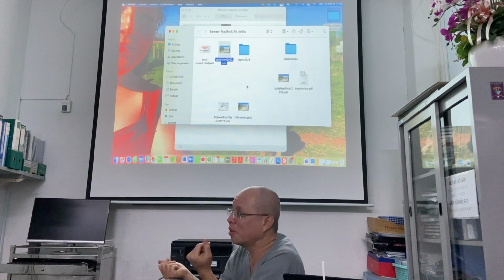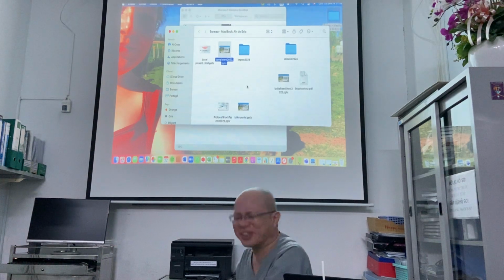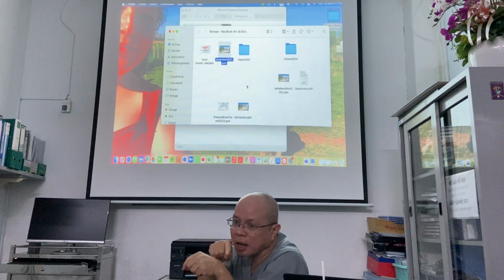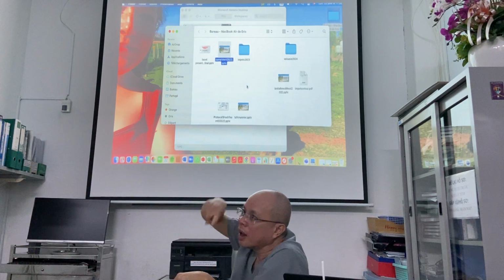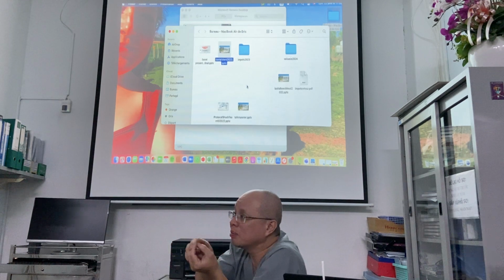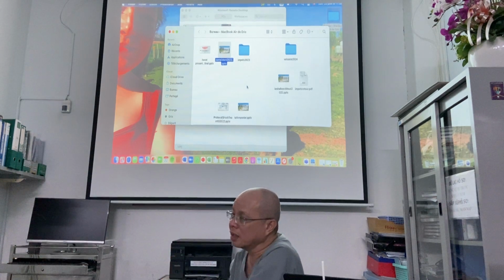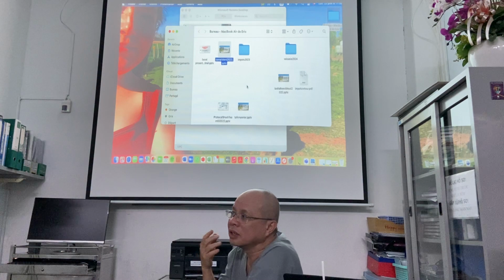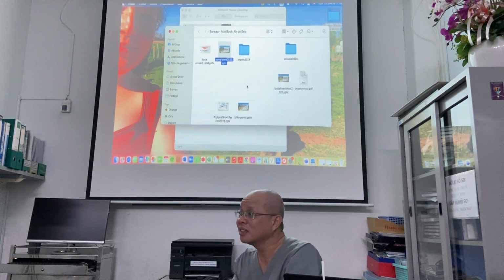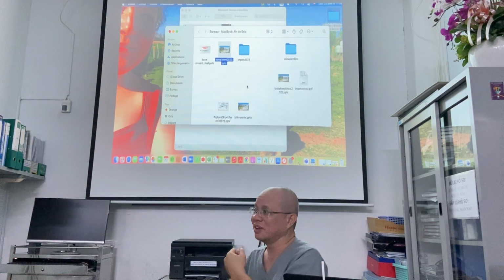Okay. So I think like this. Fantastic. I also insert the drain, and we will keep it there, because I'm afraid of recurrence. Of course, you need to leave it overnight, at least 24 hours, and discuss with the cardiac surgeon. You did well. So step by step like this, and the next day, the 7th day, it is okay. That's good.